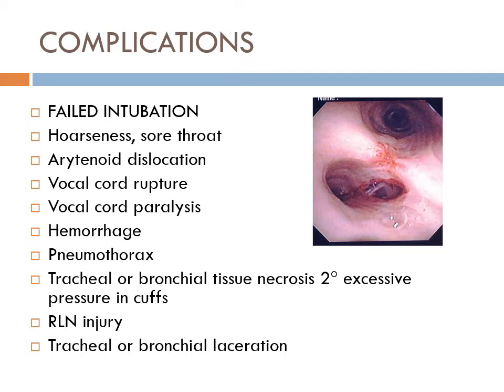You could be flipped upside down, right? And you could also be distal to the carina, where if you think that's the carina, you're actually too far in, which could be a concern if you're trying to ventilate someone and now you've cut off perhaps ventilation to the right upper lobe. So first of all, is up up, and is down down? Is the picture up the patient's anterior, or is it their posterior?